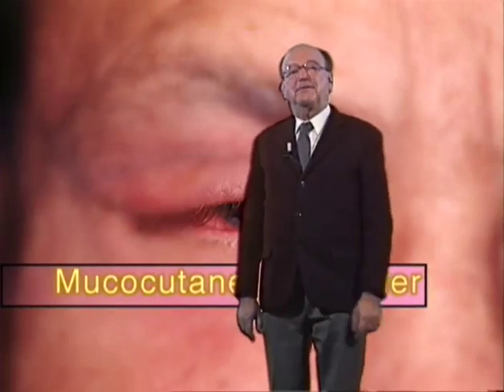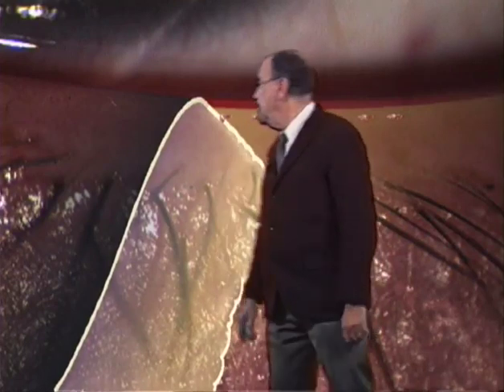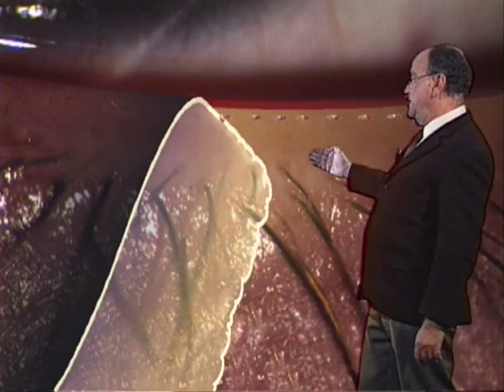One of the important topographical landmarks is the border between cutaneous epithelium and conjunctival epithelium, that is, the border between dry and wet. Actually, the position of this border determines whether wet or dry tissue comes in direct contact with the globe.